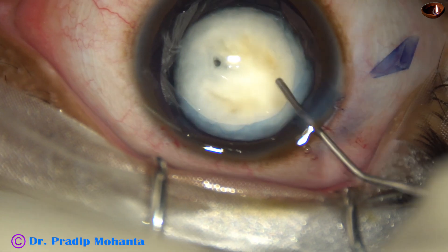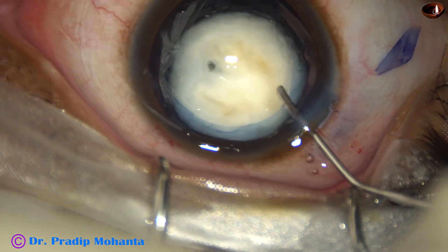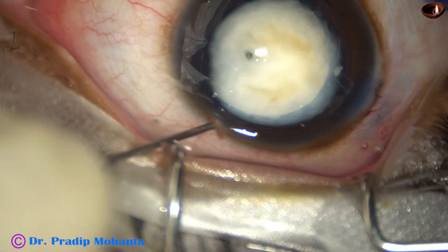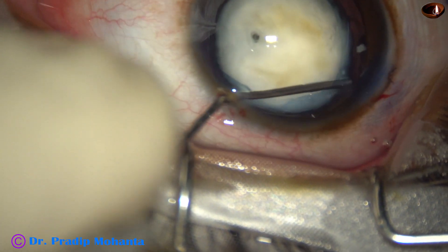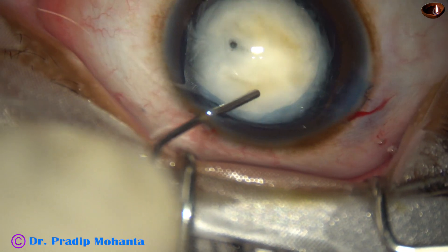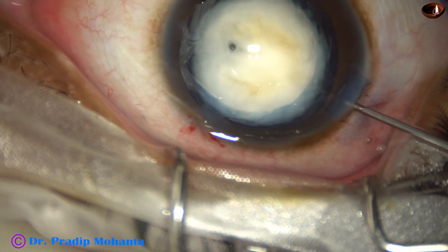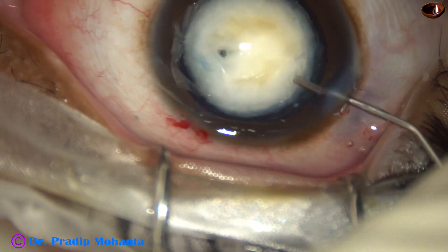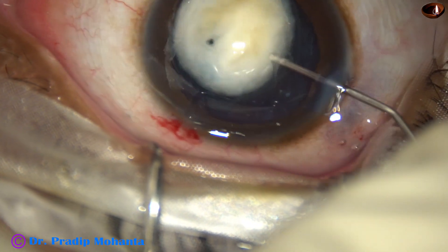Now I am trying to prolapse this nucleus out of the bag. Going through the side port, doing some hydro at 12 o'clock to mobilize the lens all around, and I can bring it out of the bag.